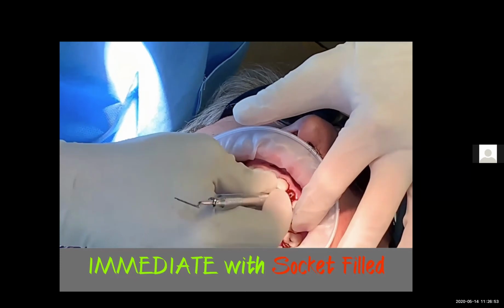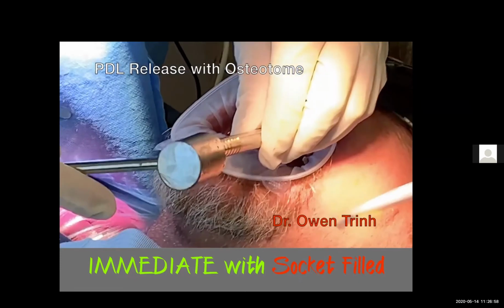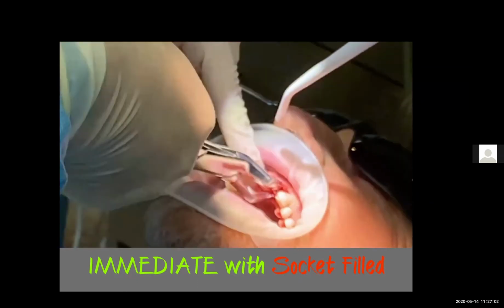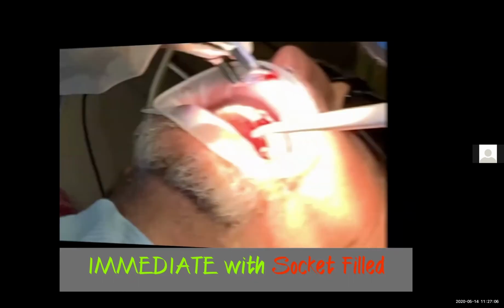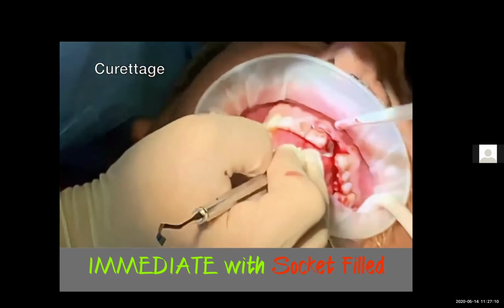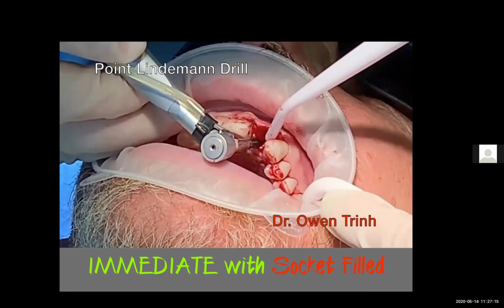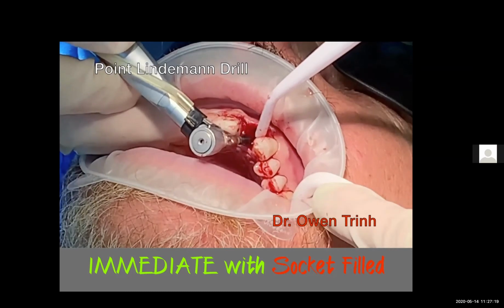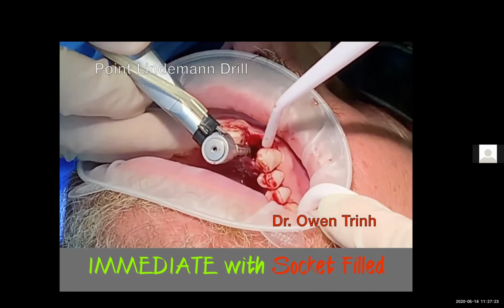You're seeing I'm using the periotome to atraumatically remove the root. Then the sockets are curetted to remove any remnants of soft tissue or periodontal ligament. Now, what I want you to pay attention to here is the difficulty with controlling the drill due to vibration and slippage on the socket wall.